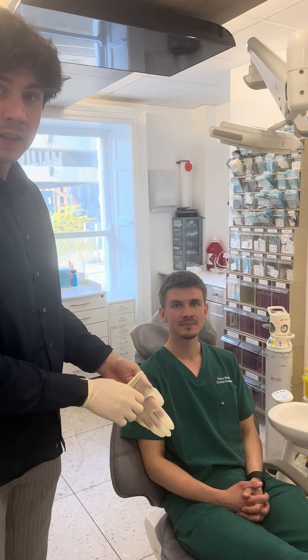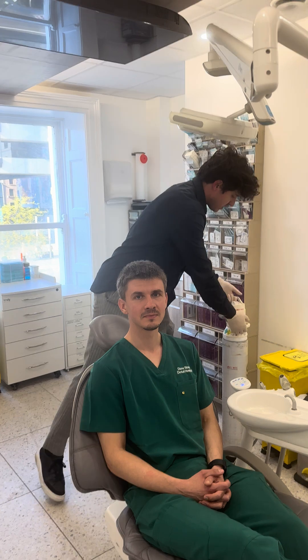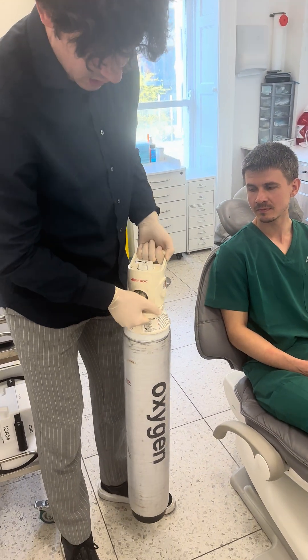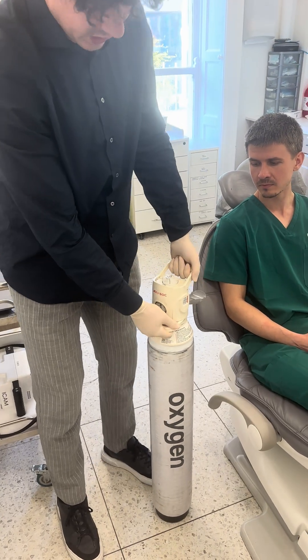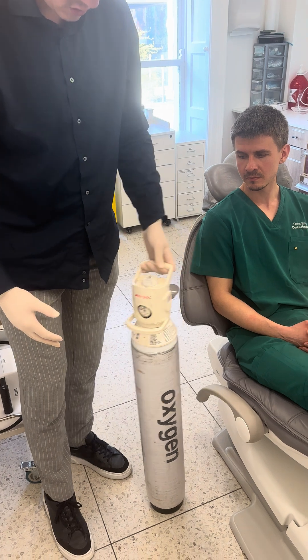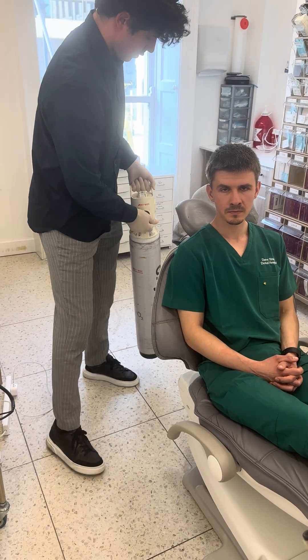We're demonstrating the use of these cylinders. First of all, you hold it with two hands here. If you're removing it, be careful with knocking it over — we actually have dedicated holders for these. If you're placing it on the ground, just don't accidentally knock it over. The best position to have it is behind the patient, and we'll go through why in a minute.